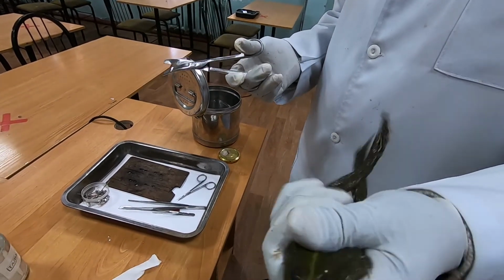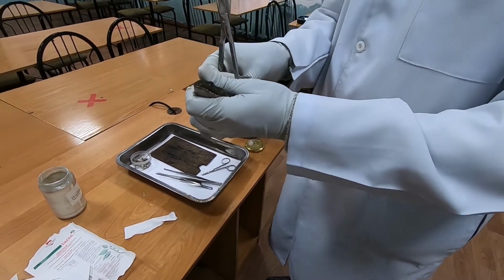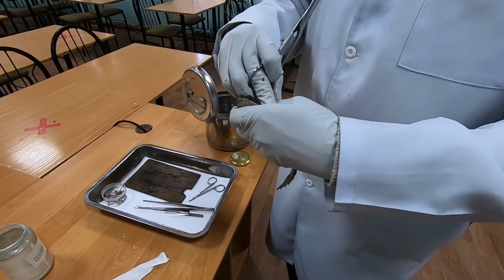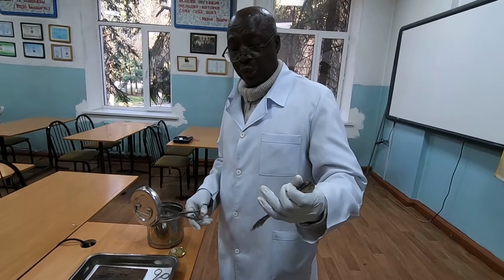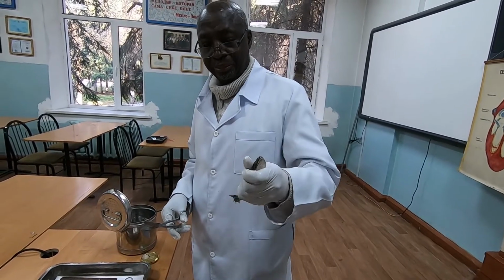You remember our system or standard of immobilizing any kind of animal. Like the frogs, we have to paralyze the central nervous system.